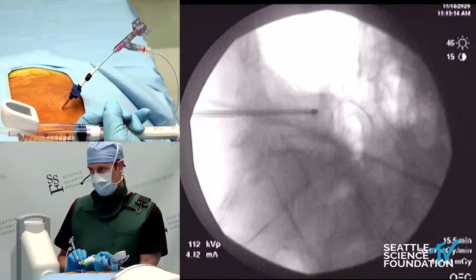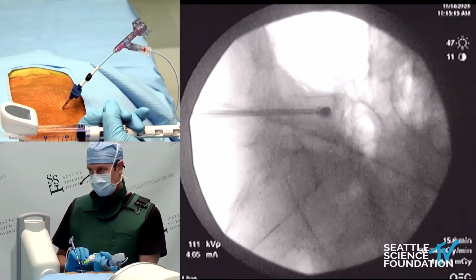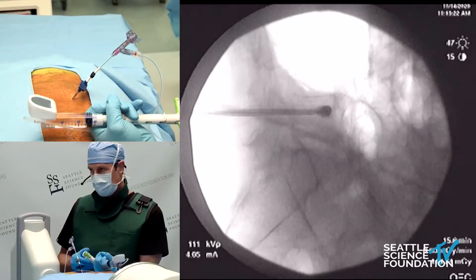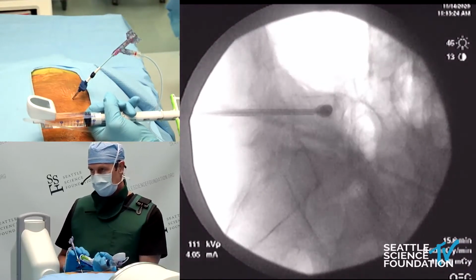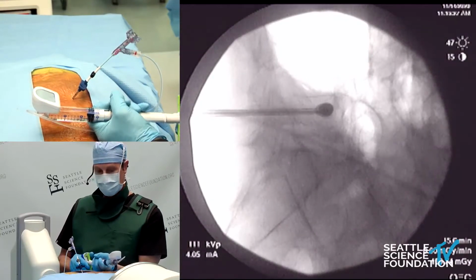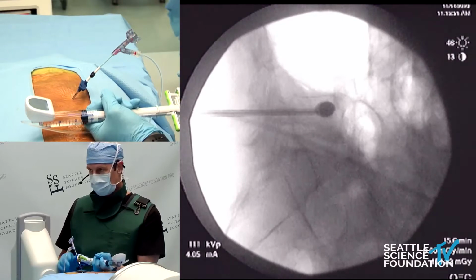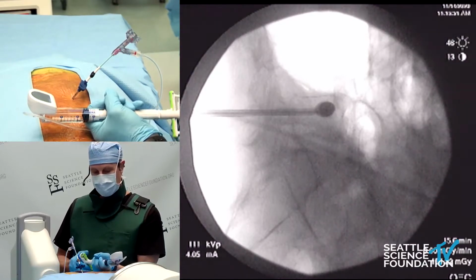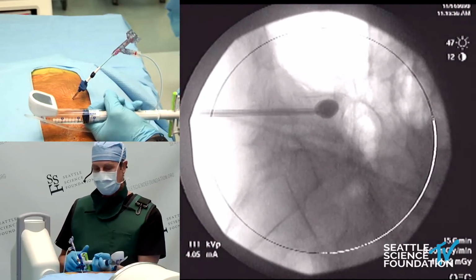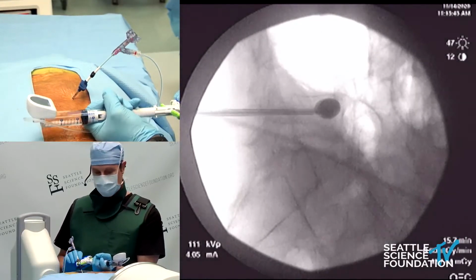It's a 30 millimeter balloon. It's a big one. And this is located more medial laterally. I find this balloon to be advantageous when you're reducing vertebral fractures that primarily affect the middle and anterior portion. So this is really something that does very well. So the pressures now are in the range of 170 to 180 psi and dropping quickly. With each turn, I'm going to continue to inflate.